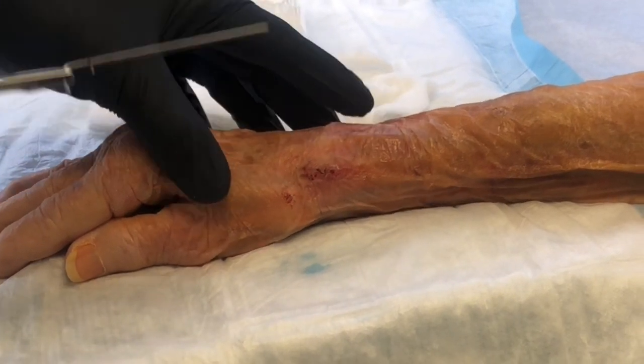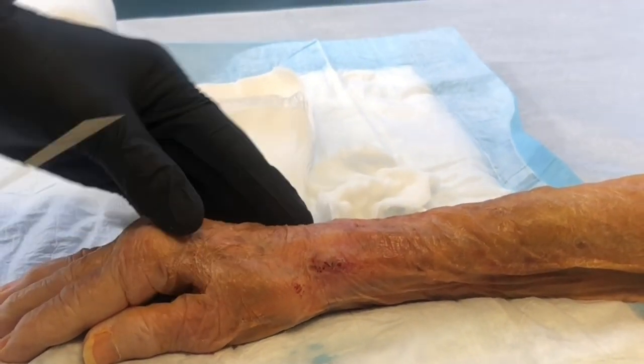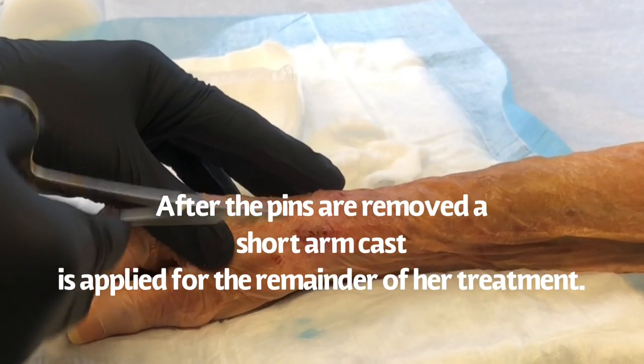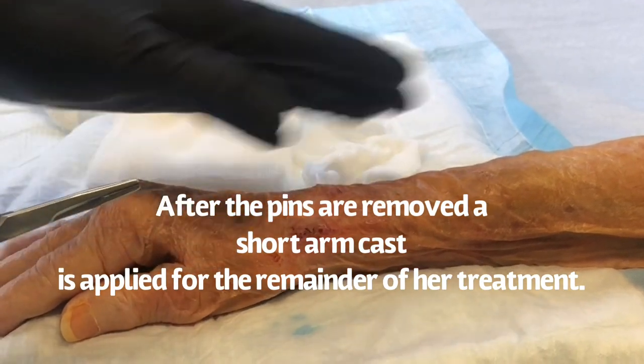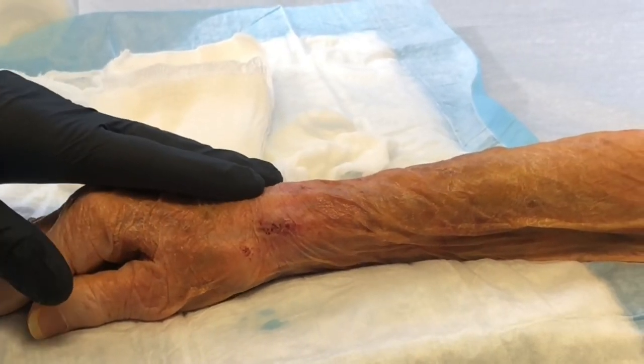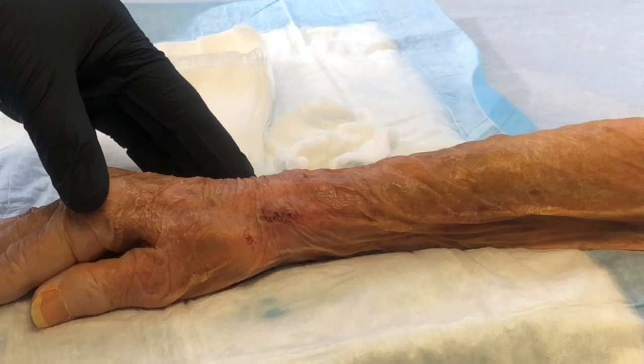Just wanted to show you what pin removal is like in the office. As you can see, there was a little bit of discomfort because that pin was really hard, but otherwise they come right out. The other thing that's beautiful here is that the wrist is nice and straight. Just wanted to demonstrate what it's like removing pins in the office.